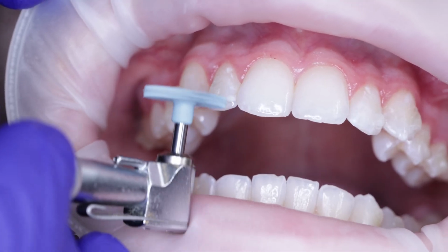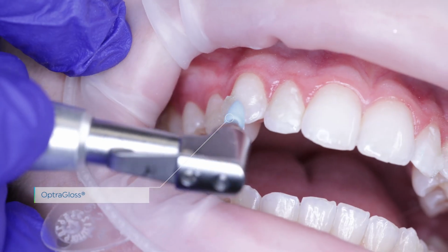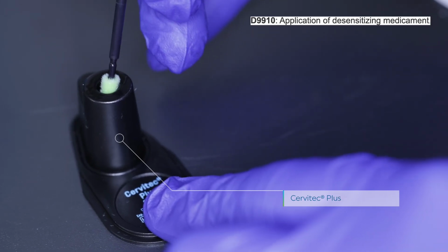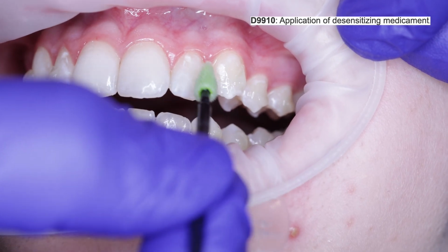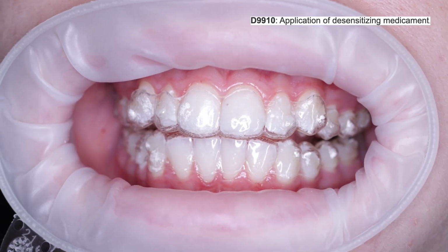So again, I'm removing it, we're polishing it, we're going to go with our polishers here, and we're going to use our Cervitec Plus to make sure that we, again, and I love this brush. Oh my gosh, I mean, you will too. I'm going to tell you, I go around every attachment and I tell patients, hey, we're going to protect these attachments, make sure we don't have any plaque buildup. We know about brackets and wires.